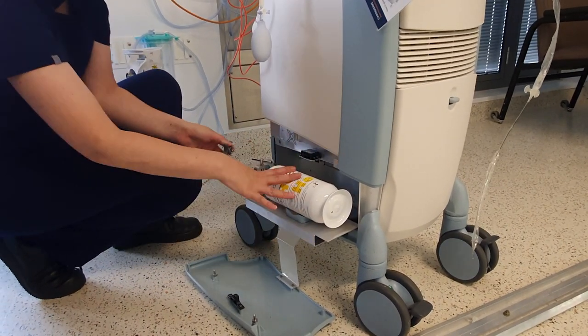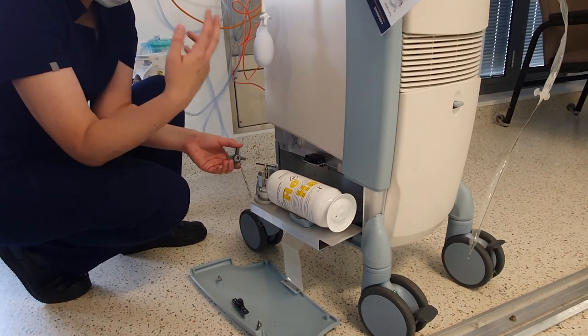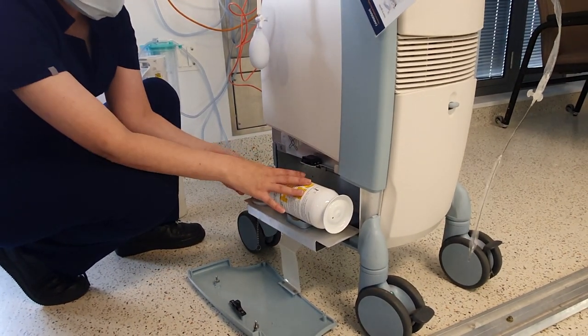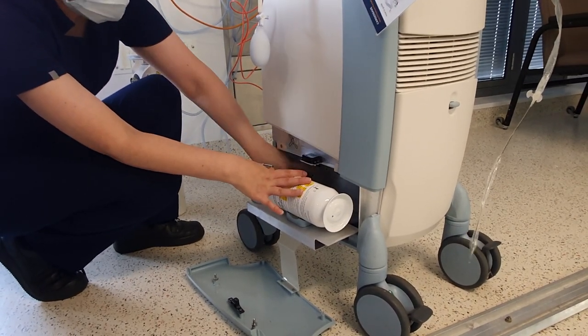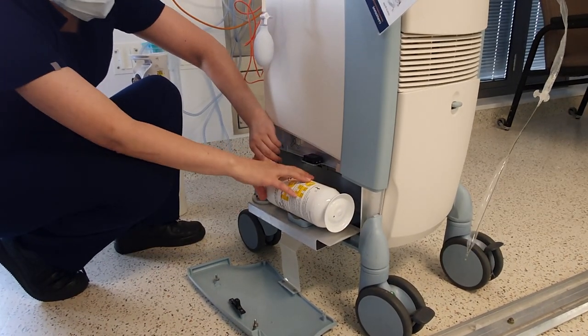The helium tank will be open because that's how the machine actually takes gas every two hours. So what you need to do is close it — righty-tighty to close, lefty-loosey to open. So I'm going to turn towards the right, and then you're going to take the old helium tank out and unscrew here.